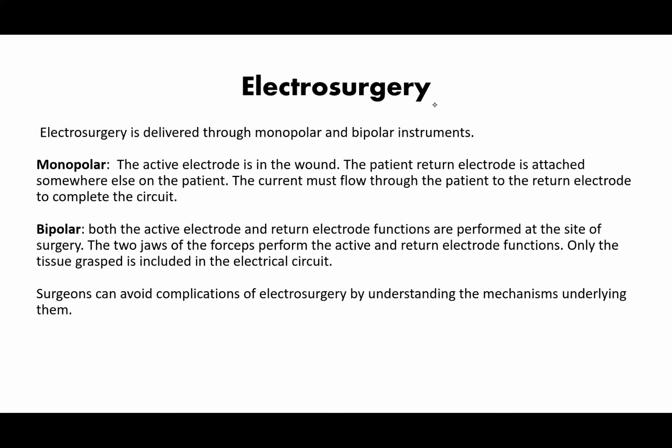If you remember your diathermy pencil, the one you use in cutting or coagulating, the one you are placing in the tissue you are cutting is the active electrode. The patient's return electrode is attached somewhere else on the patient.